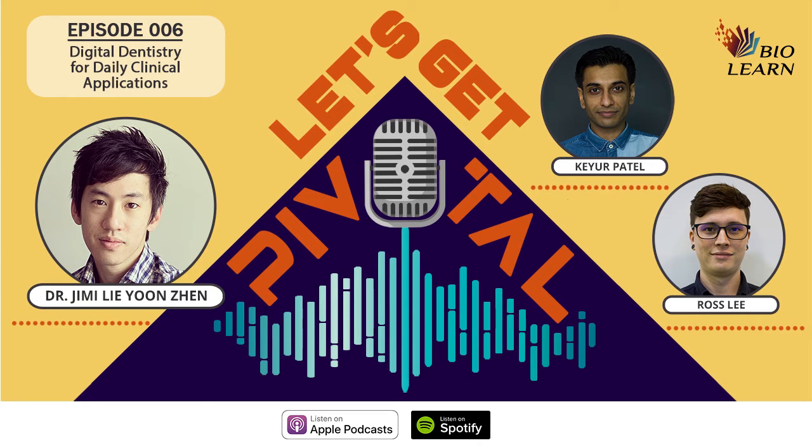Maybe one day ceramics, because there are definitely 3D printers out there currently that can sort of do ceramics. I think Formlabs is one of them actually. But I think it's the shrinking factor. There's a lot of issues with the resin, still R&D. But from what you're describing, you pretty much cover the entire gauntlet. You pretty much do everything possible in dental with a 3D printer.